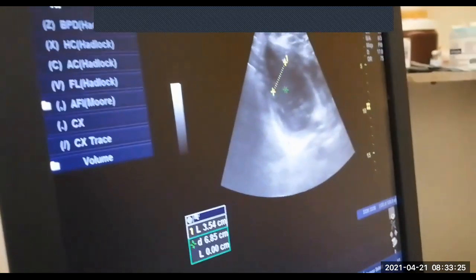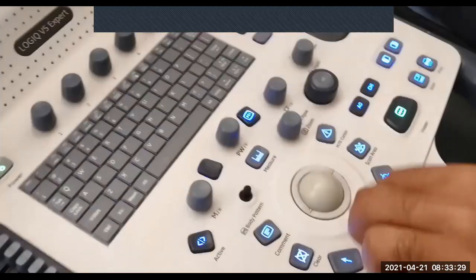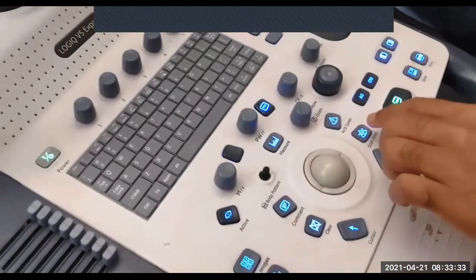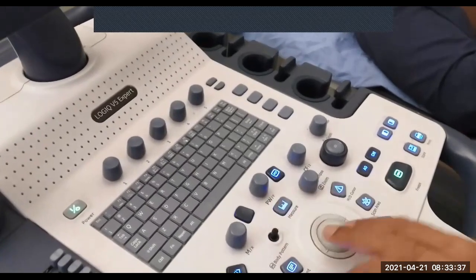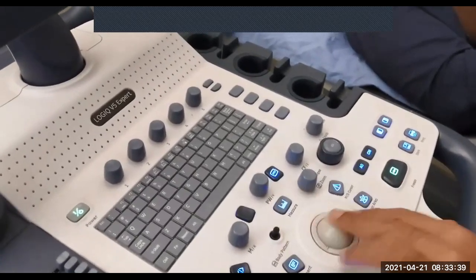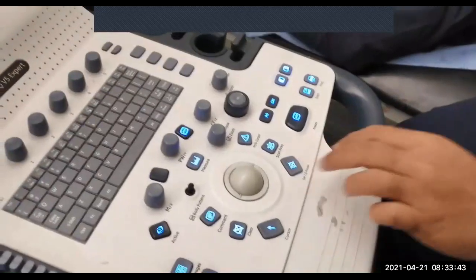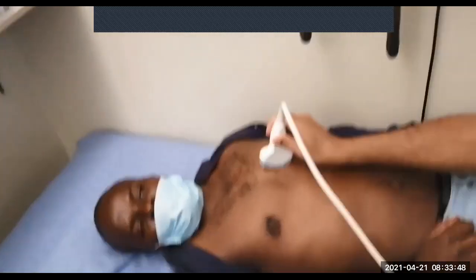All right. And then what we're going to do is let's take it out from there. Sorry, I just need to exit from that. Where's the back now? It's somewhere here. Let's take it out from there. Okay, let's measure. Oh, it's just not moving forward. All right, let me unfreeze it. We'll just get this again. Sorry. So we know our maximum is 3.5.